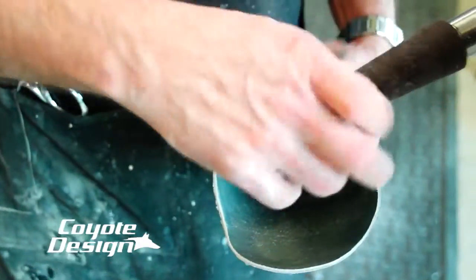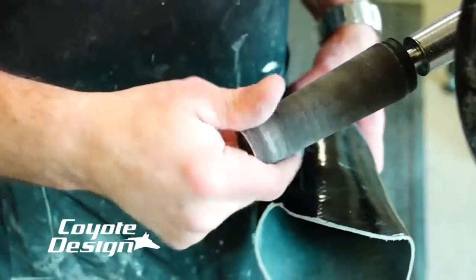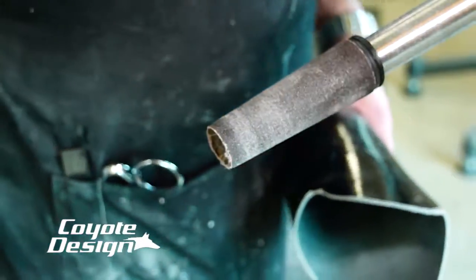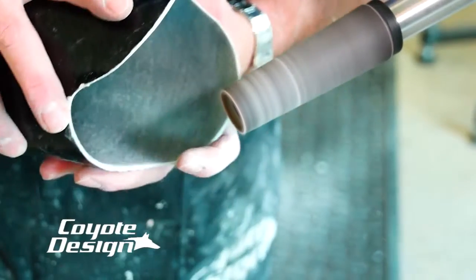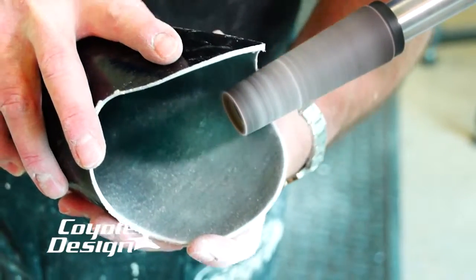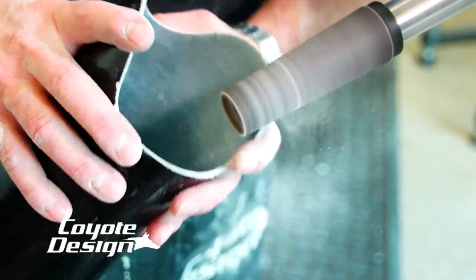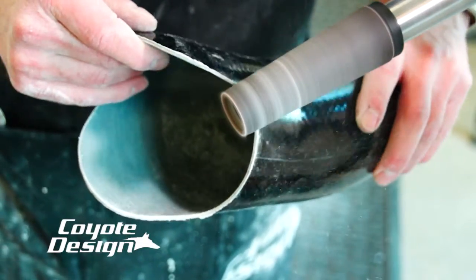So after using the rough cone, on this application I'm going to go ahead and use a finer cone, just go with the direction of the cone, and just hit my edges. After I go rough, I go down to a finer cone, run my outside edge, inside edge, and then get ready to polish it.